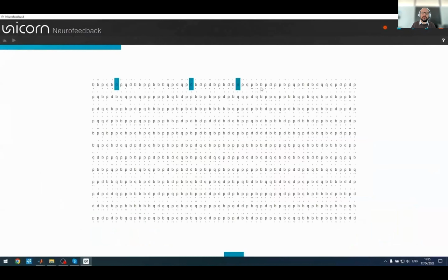They had to click all the D2s. We were trying to detect it. We can see them having a look. And then they also had a relaxation task by looking at the cross. And then you could see how engaged they were.